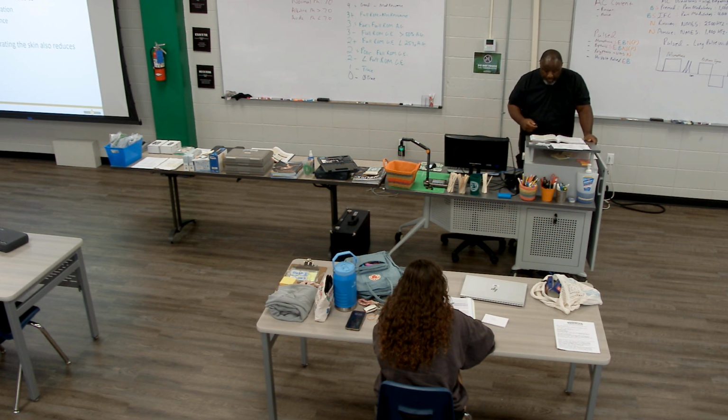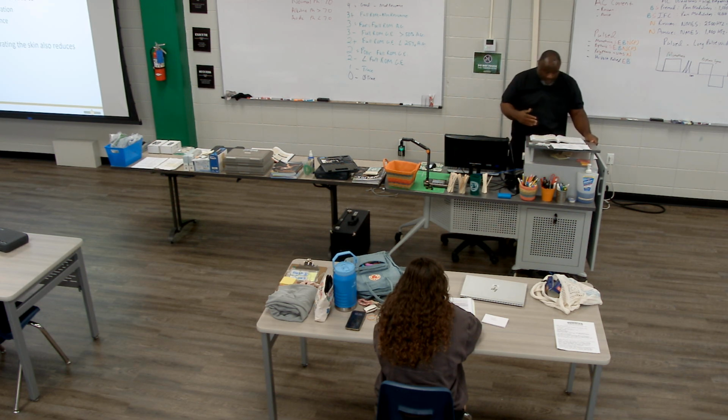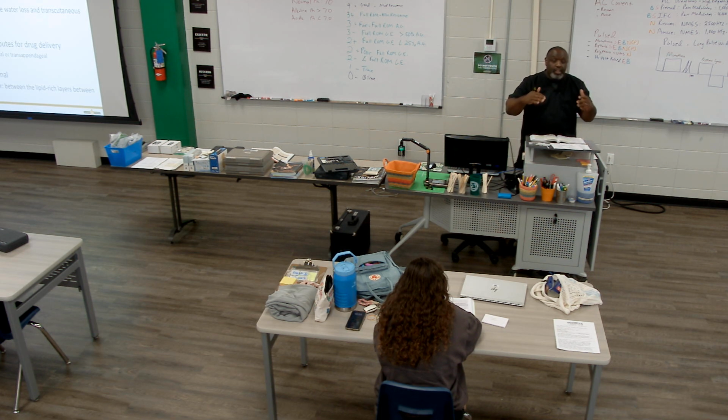Okay? So it says down at the bottom, hair follicles and sweat ducts can act as diffusion shunts for iontophoresis drug diffusion. That's the main thing we want to get. So it's the appendages known as either our hair follicles or our sweat ducts that serve as the mechanism to get current and medication through the stratum corneum into the subdermal tissue.